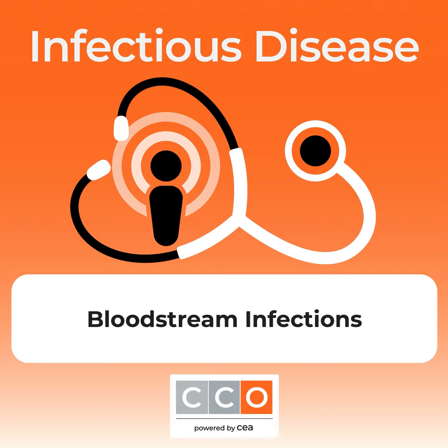You want to make sure that in addition to communication of these results, there's also some education available for the patients reviewing the results. Having guidelines and algorithms based on your local susceptibility data are key. Next, we want to think about our communication considerations. So who is going to be receiving these results from the lab and what will they do with them?